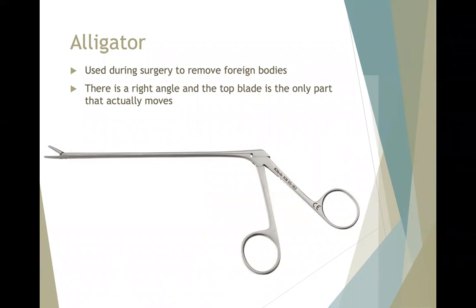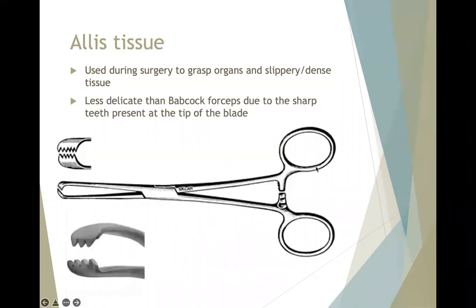So commonly seen for that, and you don't have to have these patients under anesthesia for it. Possibly a slight sedation, but they don't have to be anesthetized to do a procedure like that. So it's really just using that little gripping motion to retrieve, again, foreign bodies. That's something that should not be there. Something that does not belong in the body. It's foreign.